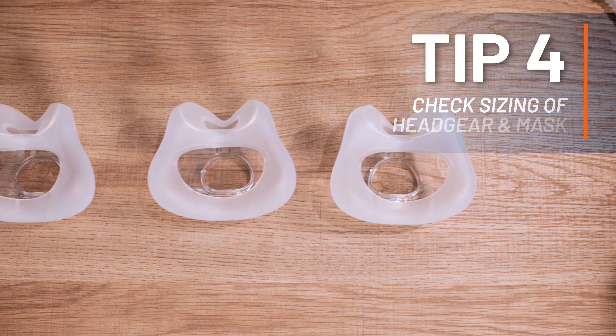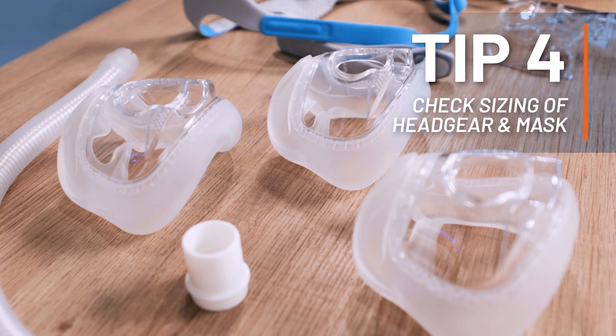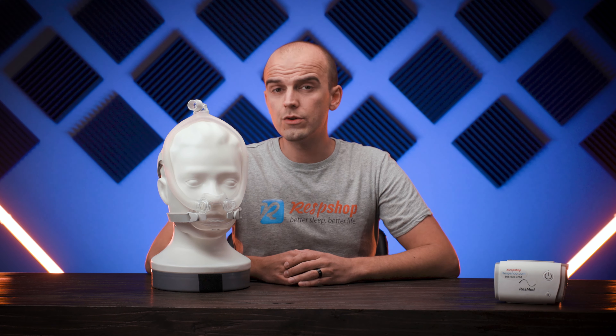Tip number four is to check the sizing of your headgear and mask, especially if you experience regular leaks every night. You can use a size guide to find out what size you should be using for your mask and cushion. Don't be afraid to mix and match different sizes of mask and headgear if the results are a better fit that way. A snug fit is essential to a good seal. If you have questions about what size mask you should choose, get in touch with our knowledgeable team at respshop.com.